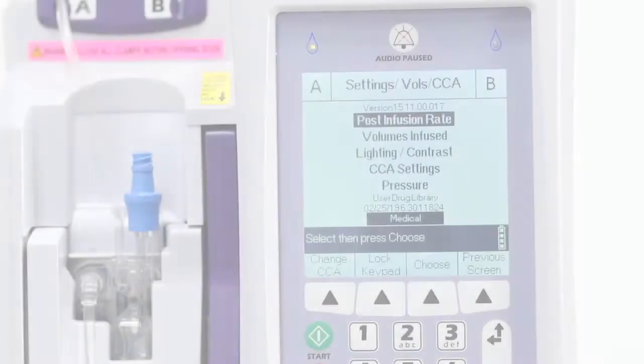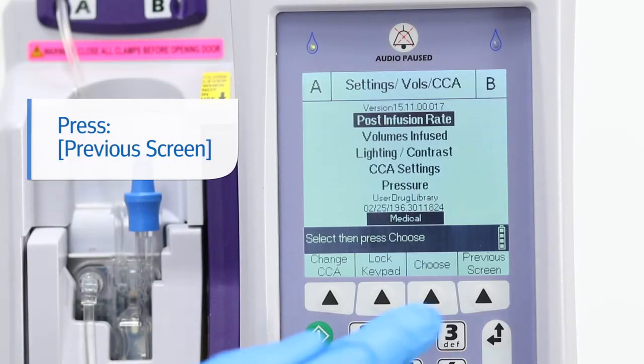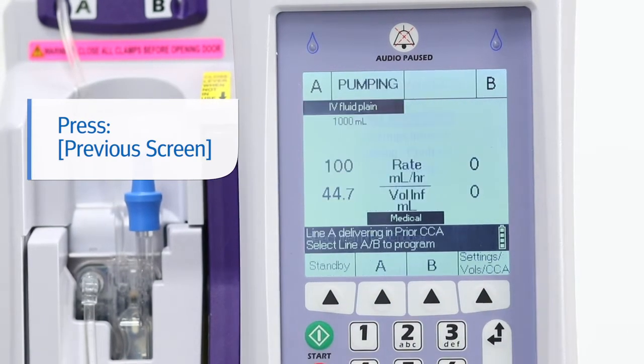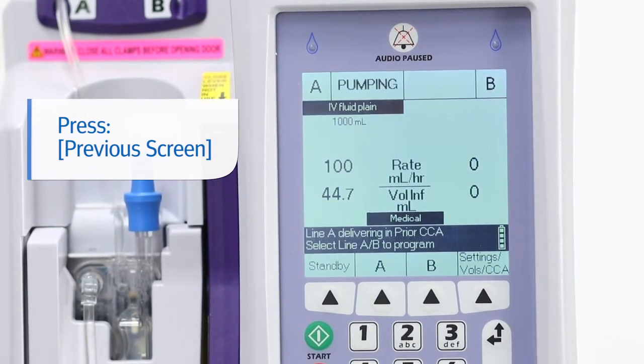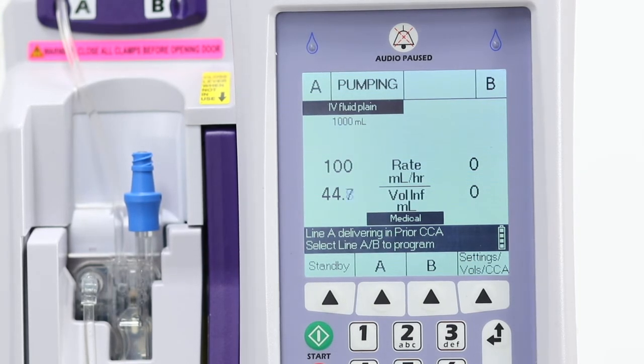Press Previous Screen to return to the main delivery screen. Once the delivery screen appears, the infuser will inform you the line is delivering under a prior CCA.